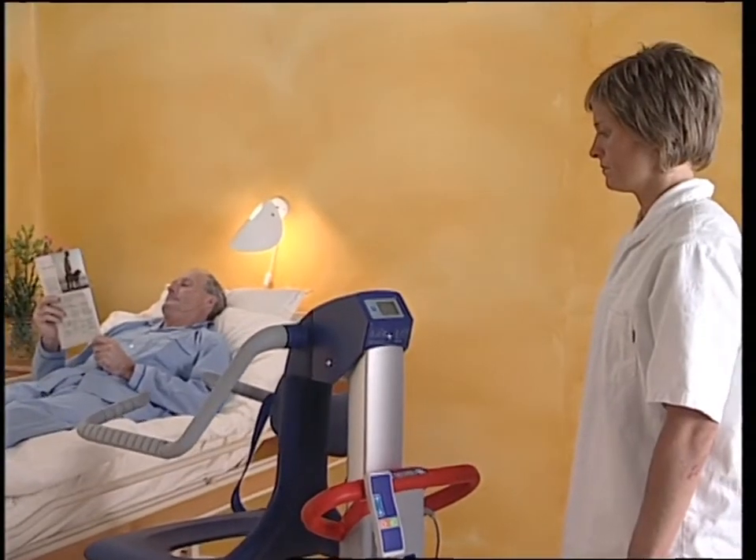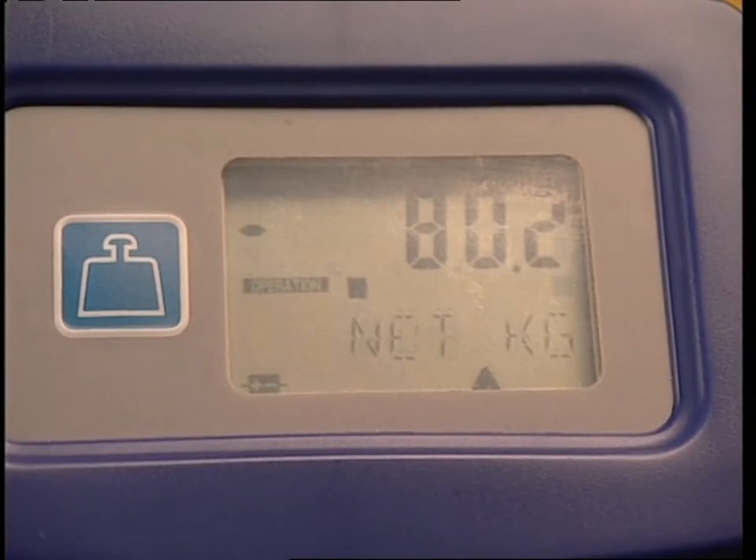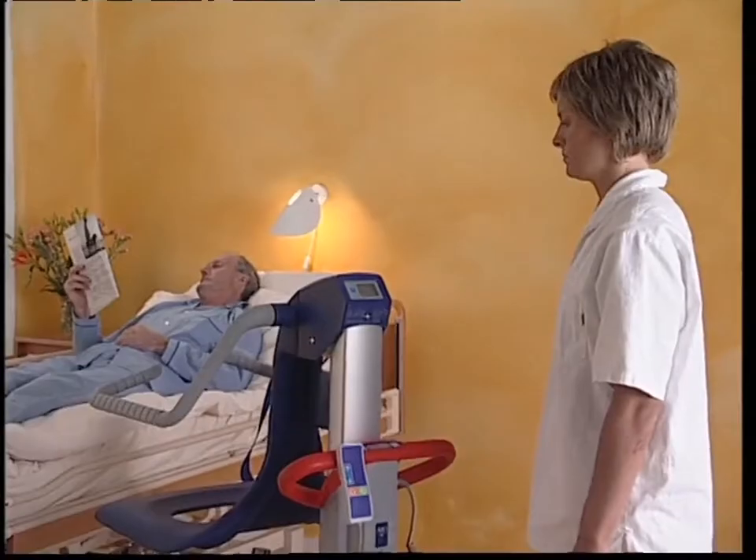When the resident leaves the chair, the display shows a negative value equal to the weight of the resident. As the chair and pillar are integral parts of the weighing instrument, do not touch them or the resident during the weighing procedure.